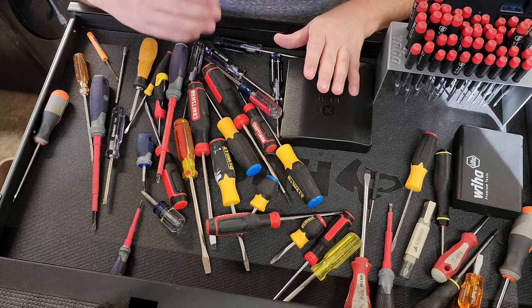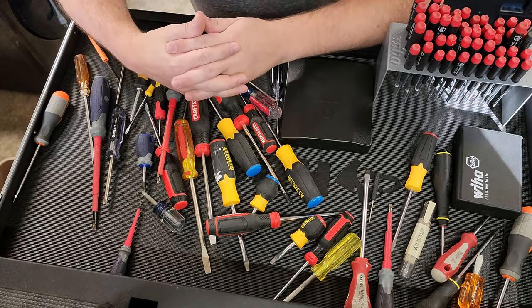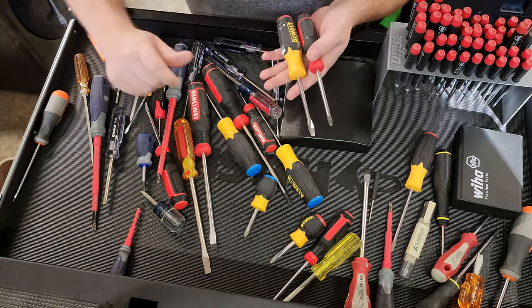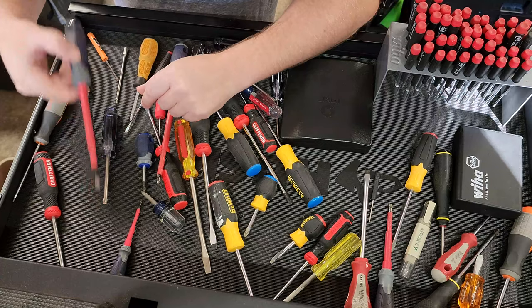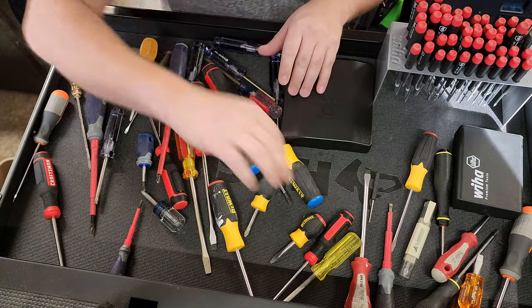Screwdrivers are going to be at the base of any Biomed's toolkit because they're going to be one of your most utilized tools. There are various types of screwdrivers that everybody probably should know, but the fact is that many of them don't. A lot of the names are mismatched and a lot of them are being used for the wrong purpose. So let's go over some of the varieties of screwdrivers right here.